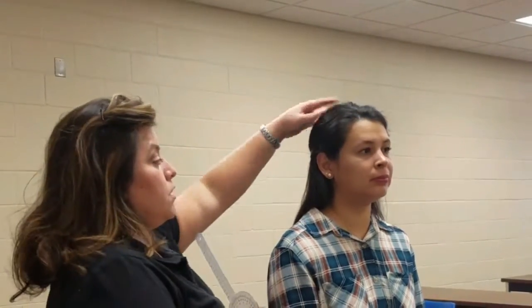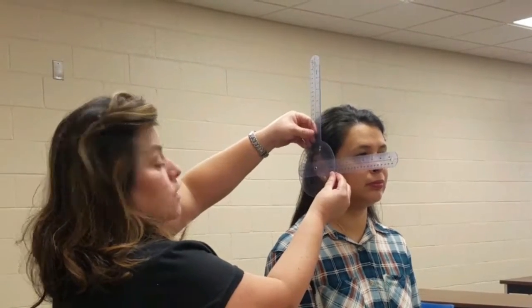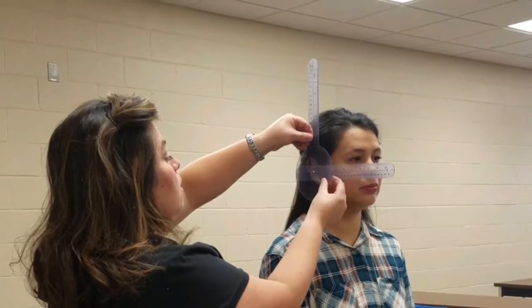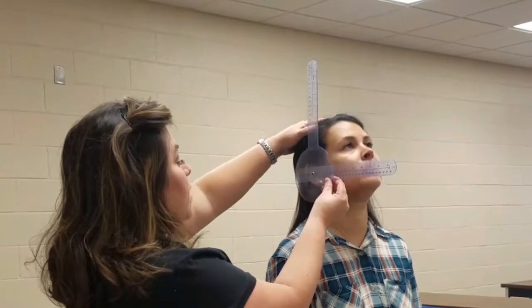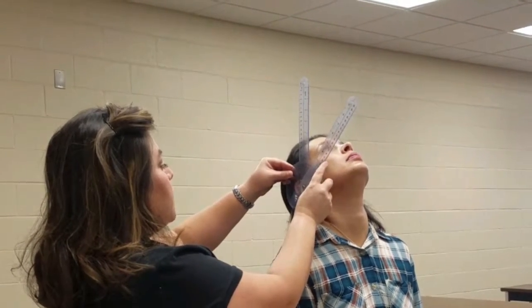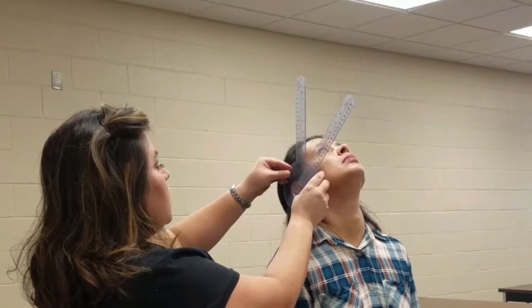And now for cervical extension, we're going to have her looking straight ahead again, realign the goniometer, fulcrum over the external auditory meatus, and the stationary arm perpendicular to the floor, movable arm base of the nares. Have her go into cervical extension. Can you put your head back? Realign the goniometer. Line it up at the base of the nares. And for this measurement, I have 47 degrees of cervical extension.